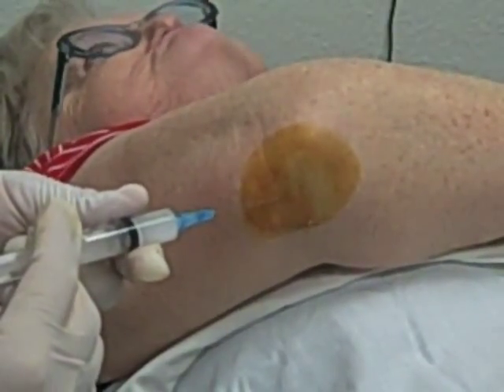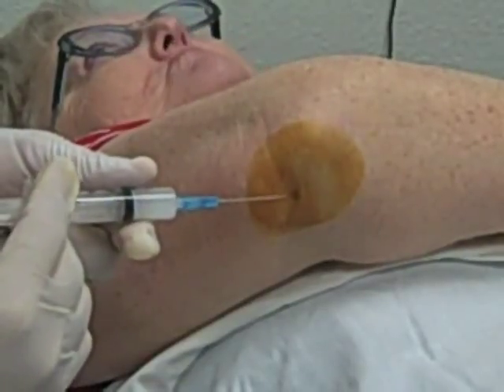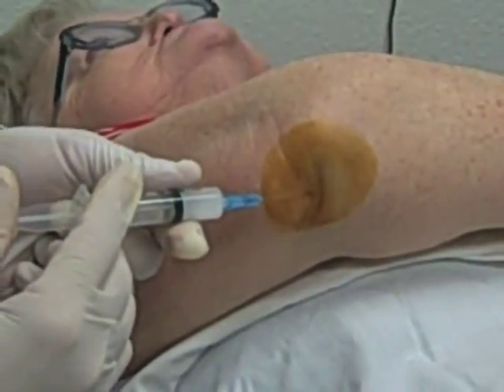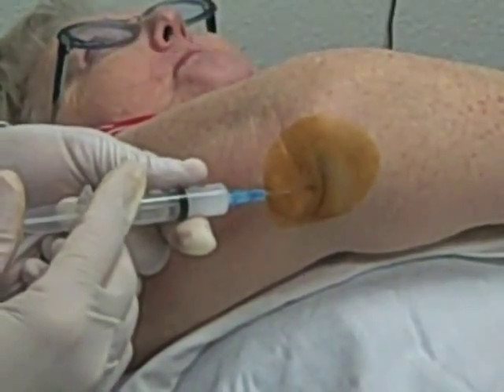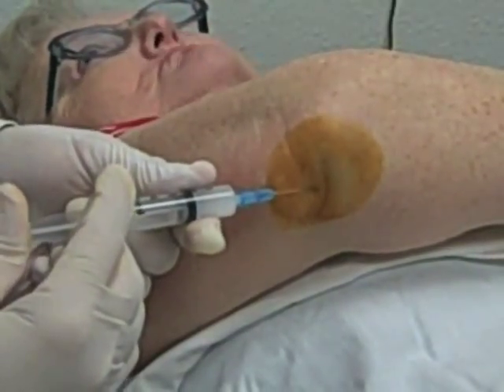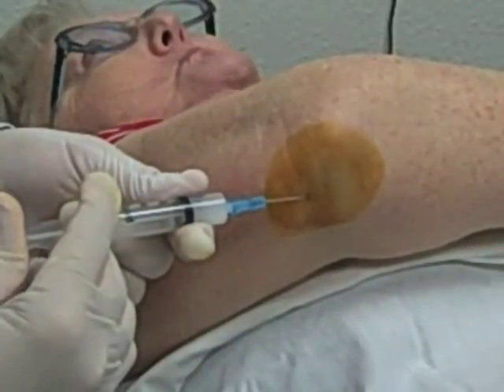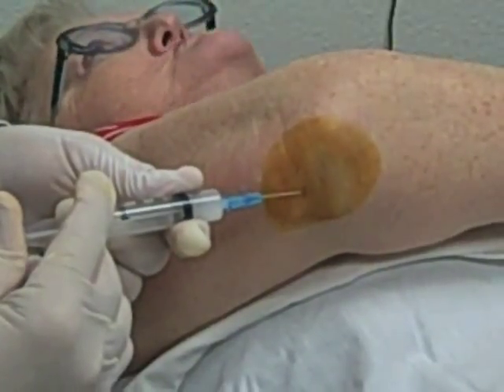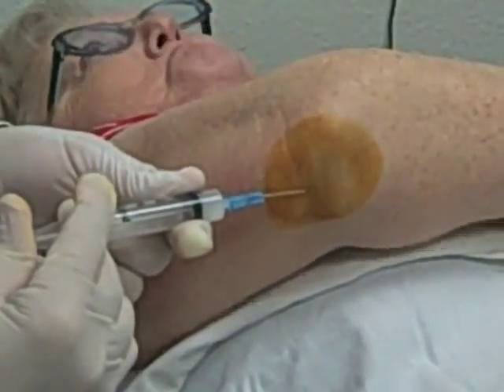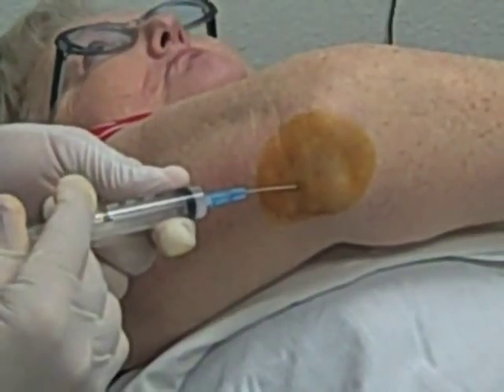The needle is going to be advanced along the course of the ulnar nerve at approximately a 45-degree angle. If the patient experiences any pain, paresthesia, or numbness, you need to reposition the needle. Also, if you encounter any resistance with advancement of the needle or injection of the medication, you need to reposition the needle and continue.